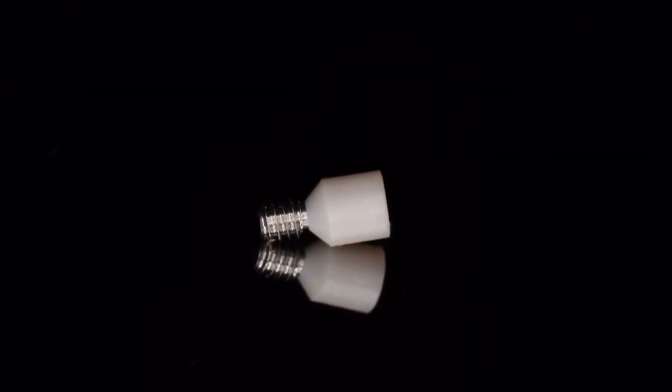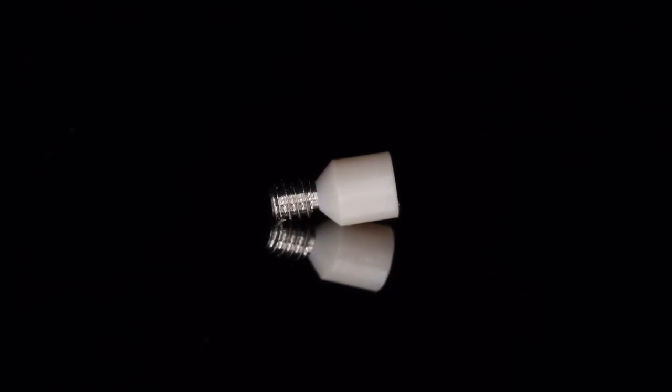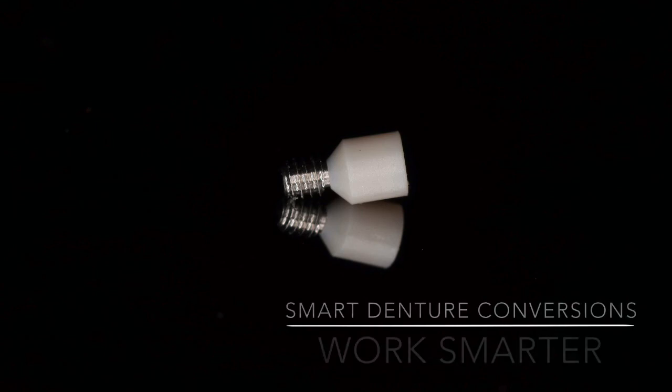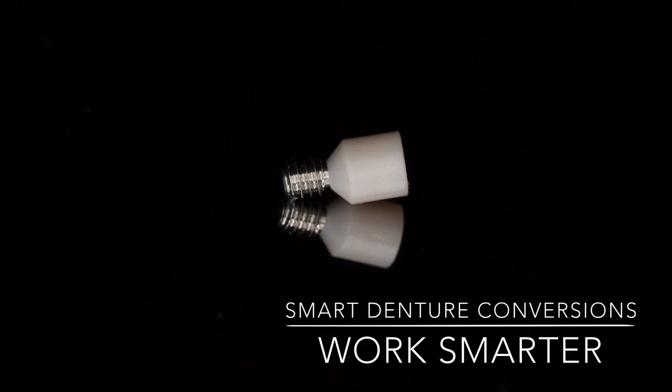This is all made possible by separable fastener technology. It has changed my practice. I no longer destroy my dentures and start over after the osseointegration period. Visit us at smartdentureconversions.com and buy your kit today.